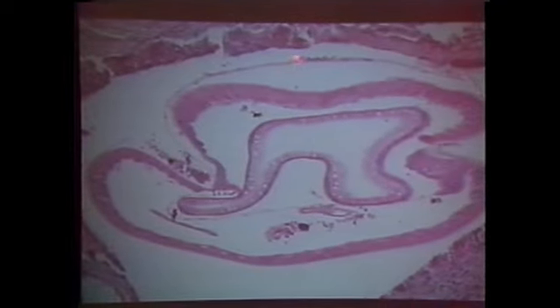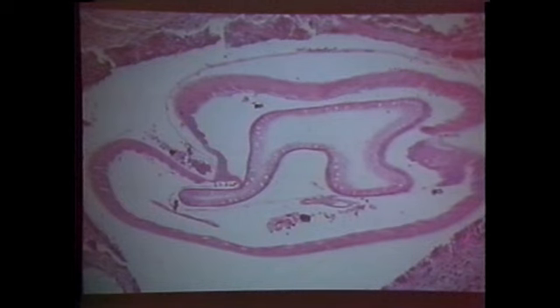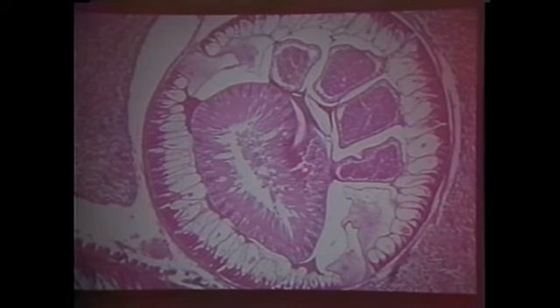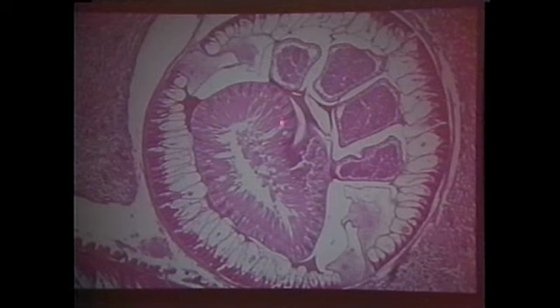I put this section in here to remind me to tell y'all that when we study the morphology of known worms, we want to have a beautiful worm. If you don't have a good worm that allows us to study what it's supposed to be if we were in heaven, then when you get these nasty things that are degenerate and stuff like that, it's very difficult if you don't know your basic anatomy. So get the good cross sections and try to correlate that with the other dead worms.